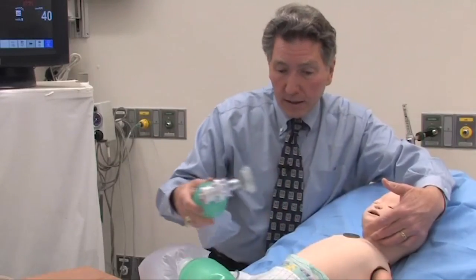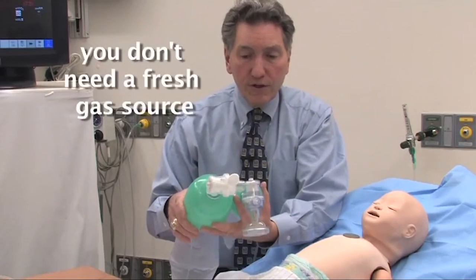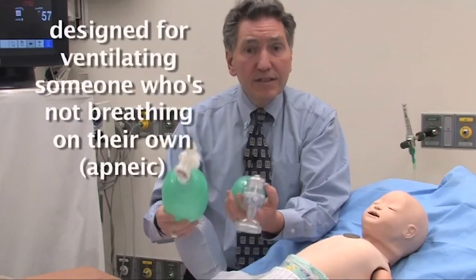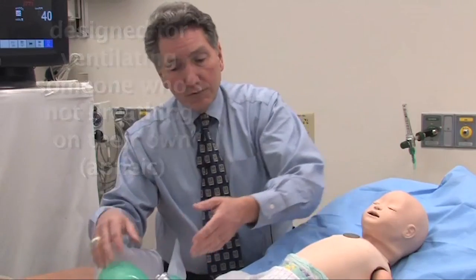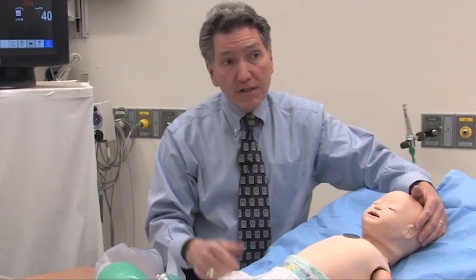So that is the self-inflating bag. The big advantage: you don't need a fresh gas source — you can do it in room air. The big disadvantage, as we'll see, is that it's really designed for ventilating someone who's not breathing on their own — who's apneic. If you have a patient who's breathing spontaneously and just needs some assistance, you're probably going to be better off with the Mapleson system, which we'll talk about now.